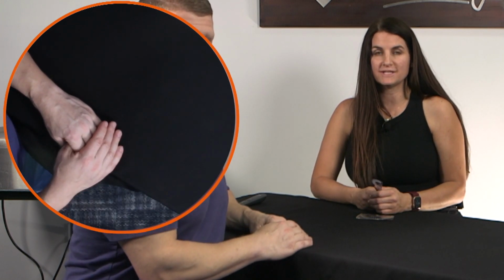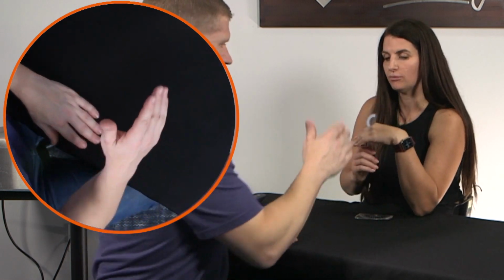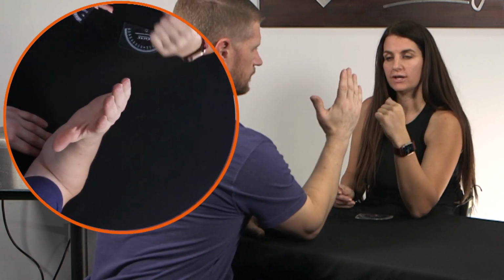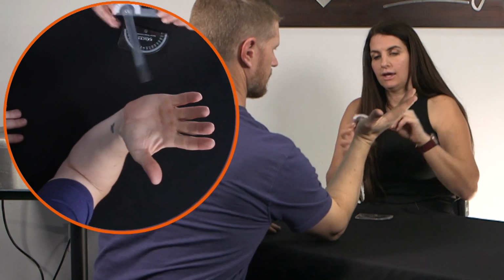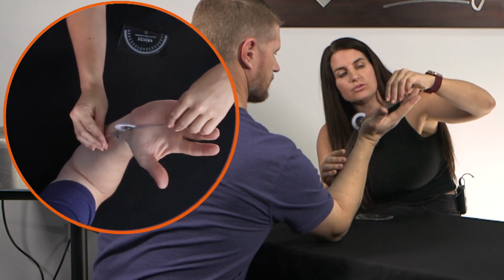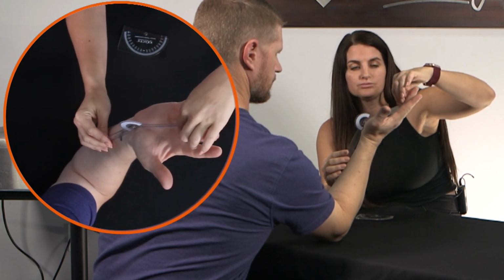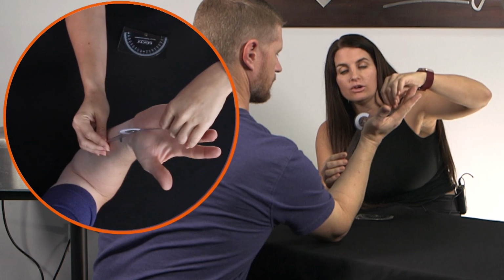Now we're going to do wrist extension and wrist flexion. So I always start with wrist extension, so I'm going to have you bring your wrist up and then go ahead and extend it back. And with this one, you want to have the stationary arm towards the forearm, and the moving arm goes through in between the middle finger and the ring finger.